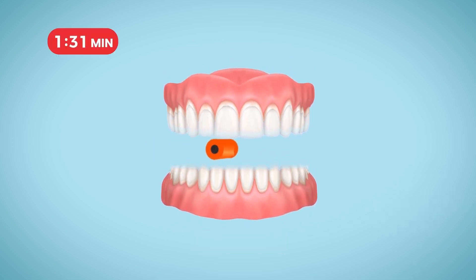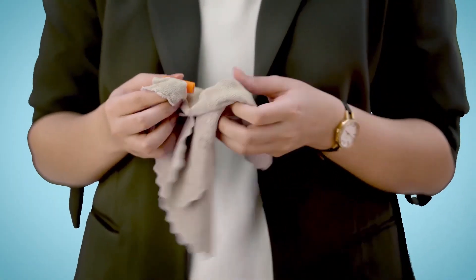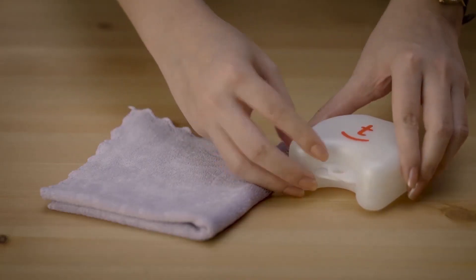Use the Chewy for up to 2 minutes from right to left. Always clean and dry it after every use and keep it in the dry box.